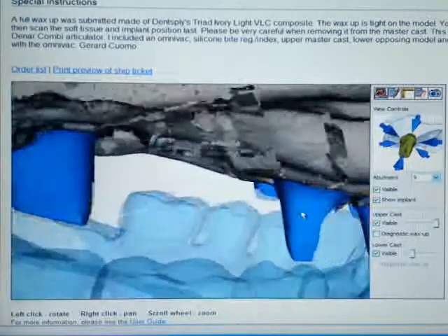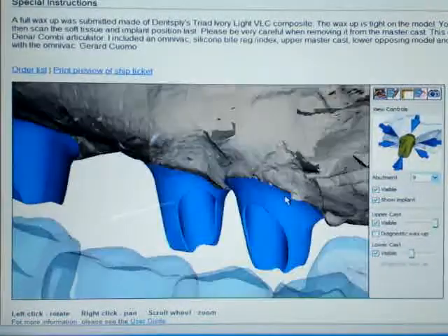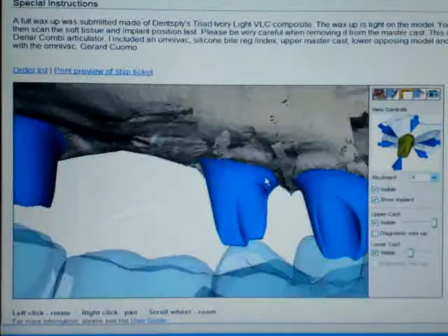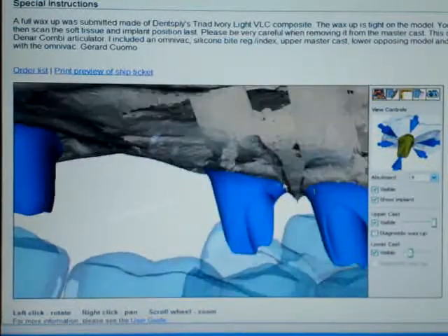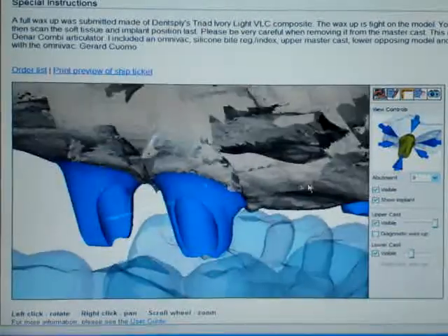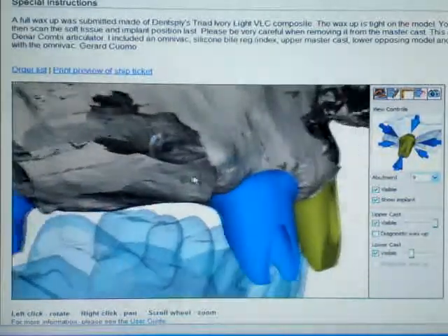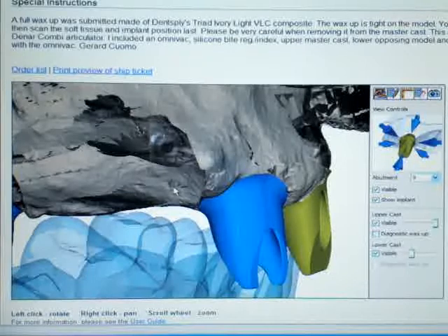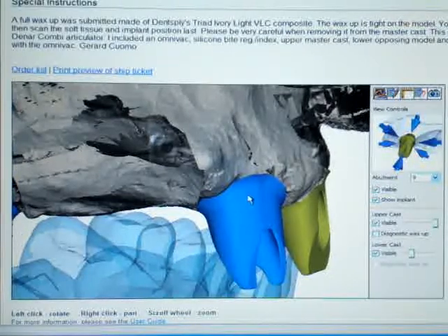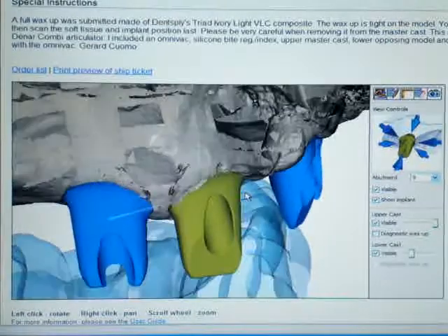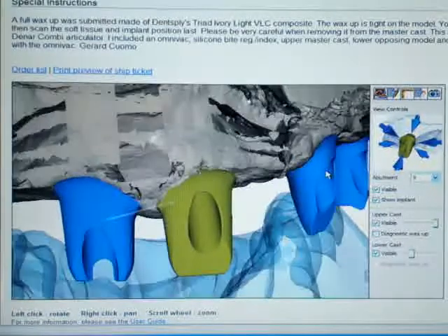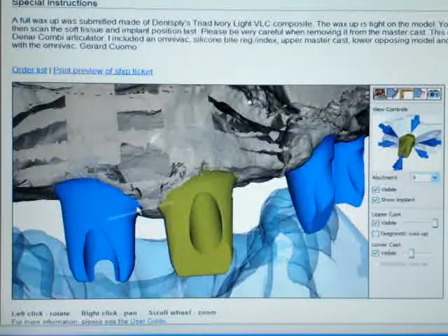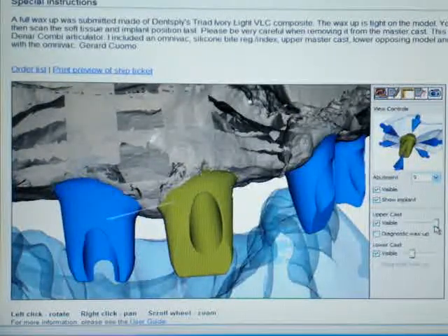So you can see where maybe they could have cleaned it up a little bit better around the soft tissue area. Now you can see the papilla here. Start to pan away. And here's the edentulous area and your anterior. So if you wanted them to design it to support the papilla a little bit more, you'd want to tell them that. And also, if you need to sink it subgingivally.